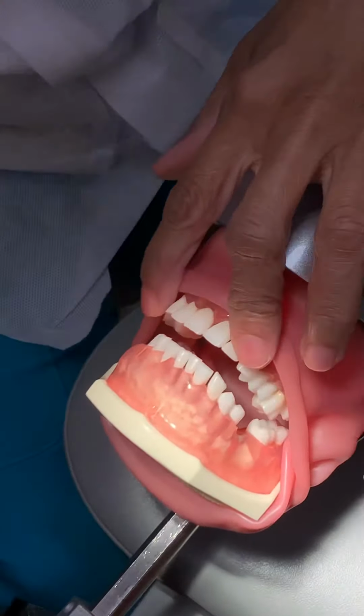I'm going to go ahead and start at this lateral here. Normally we start at the canine, but so you can see, I'm going to start at the lateral. God, I can't hold that down. Can you hold that down for me? Thank you. So I always use the tip third. I'm going to start at the get ready zone.